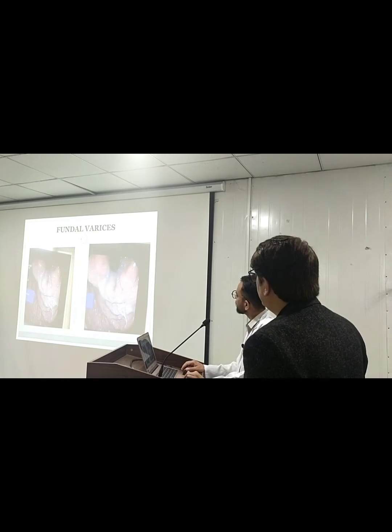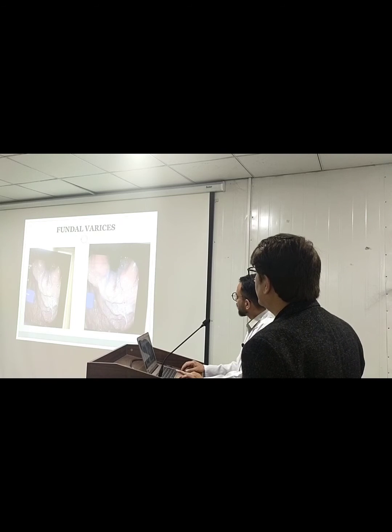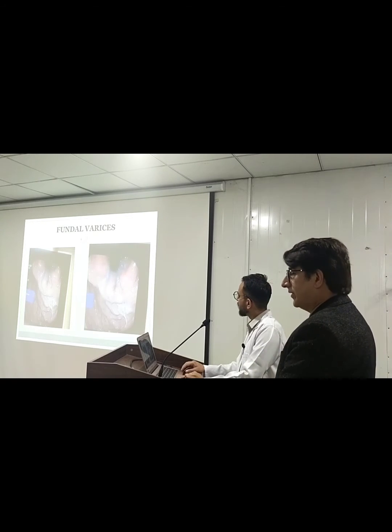Fundal varices. Yes, this is the picture of the patient. He is also a decompensated chronic liver disease patient, secondary to hepatitis C virus. So you can see here are the medium-sized fundal varices. Previously his EVBL had been done, and one time sclerotherapy of the fundal varices had also been done in Islamabad. This time again he presented, and his cause of bleed was esophageal varices, but he had these fundal varices also. So we banded him, his EVBL was done, and for the fundal varices we will refer the patient back to the primary gastroenterologist.